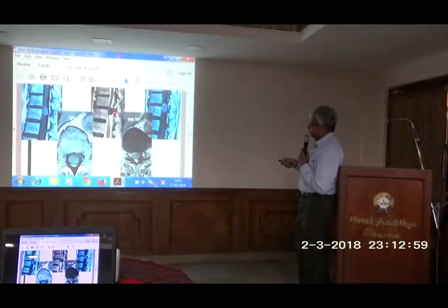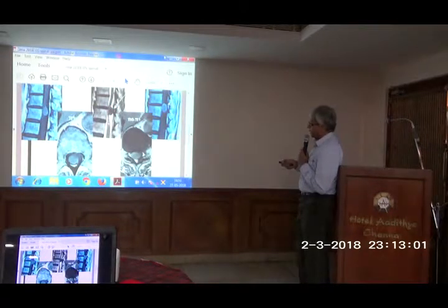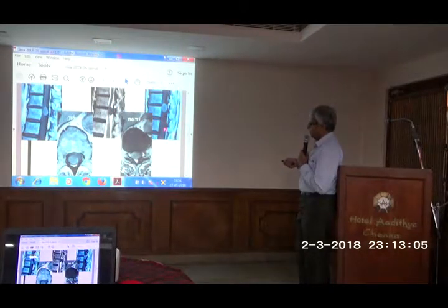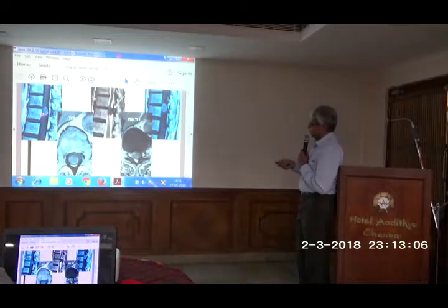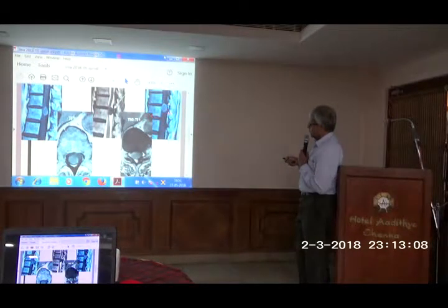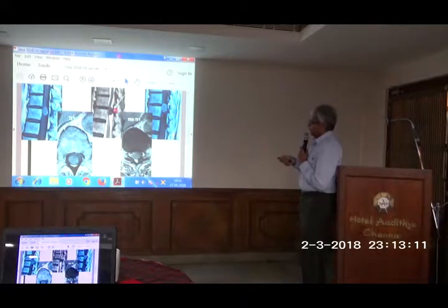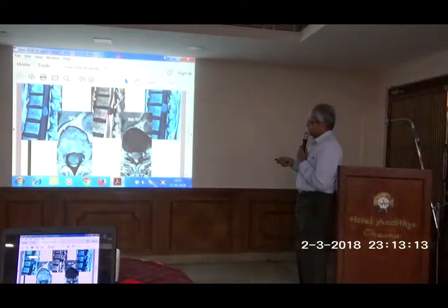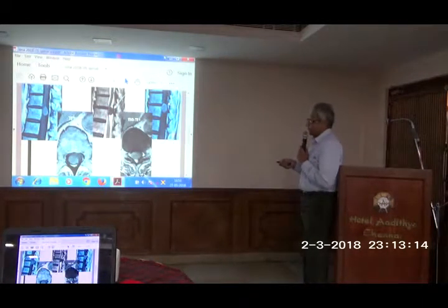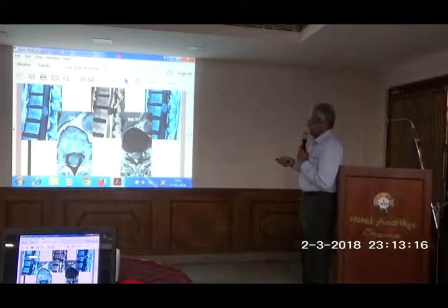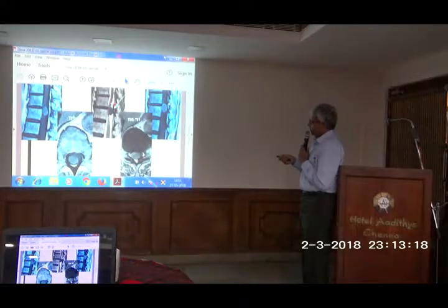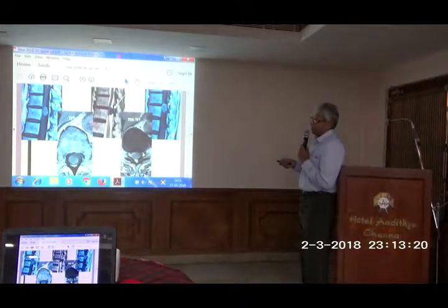Now you are able to clearly see that this black lesion in the T2 image. This is a T1 image — that is without contrast, and this is with IV contrast. Now therefore this lesion is present inside the spinal canal, within the dura, but outside the spinal cord.